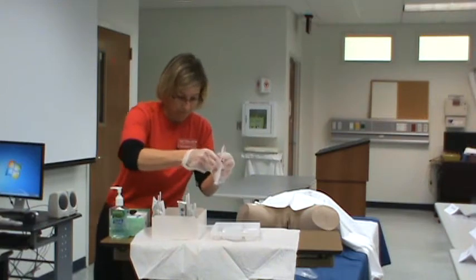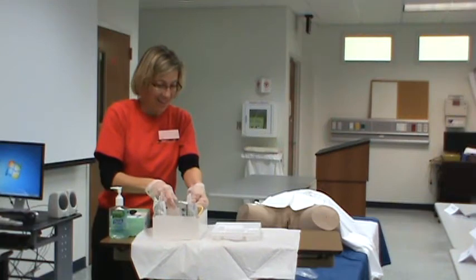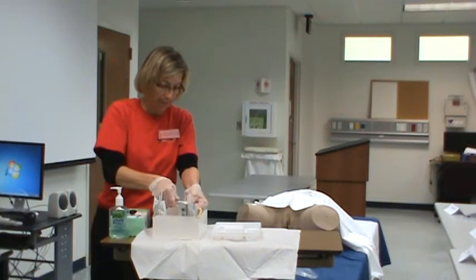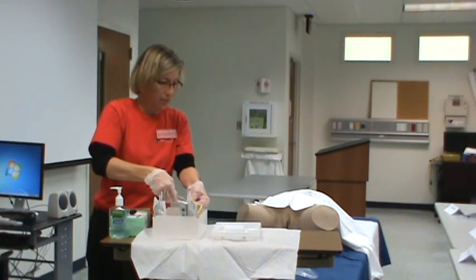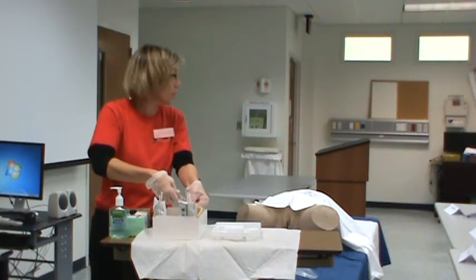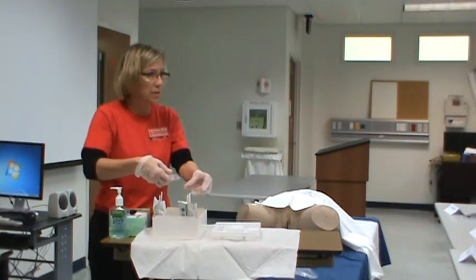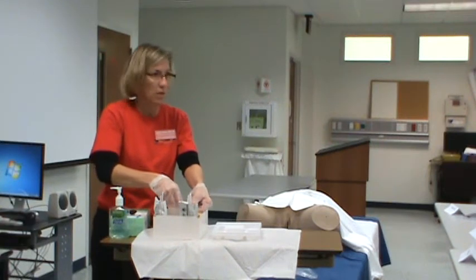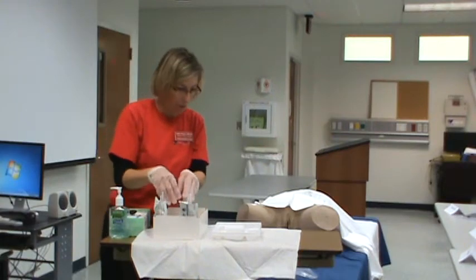Now this syringe, I'm going to put on it. The one I did the other day didn't stay on. And this one looks like it might not be either, but we're just going to adapt. We'll adapt and overcome. Normally, the syringe would stay right on. And in the facilities, that syringe will stay on, I promise. There's no pre-inflation. Some of you that have been around a while know we used to pre-inflate the balloon. We don't do that anymore. We just get ready with the syringe and no pre-inflation. So mine isn't sticking, so I'm just going to go with it.